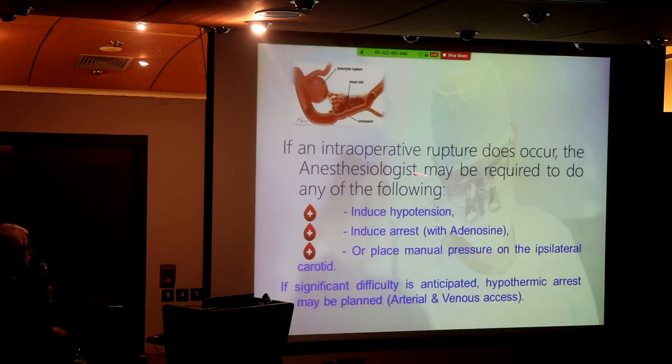Sometimes, which is novel and more recent, adenosine arrest is fantastic in this situation, especially in bleeding, or place manual pressure on the ipsilateral carotid. You might decrease, although that has its problems; we'd prefer adenosine arrest. If significant bleeding is anticipated, hypothermic arrest may be planned, with arterial venous access, or go on the pump, especially if it is dear to you. Why not?